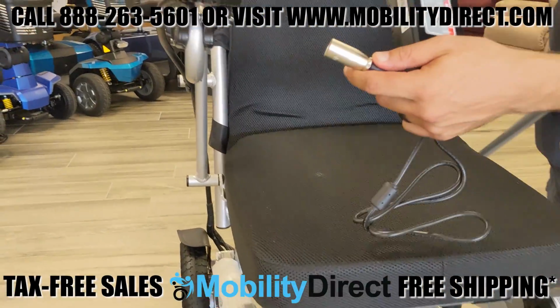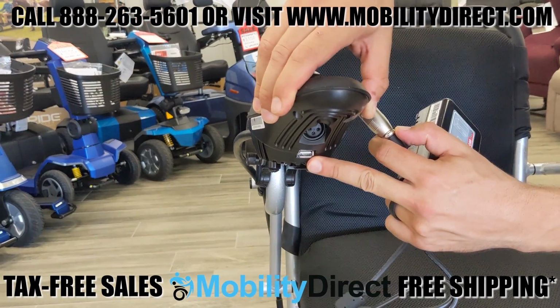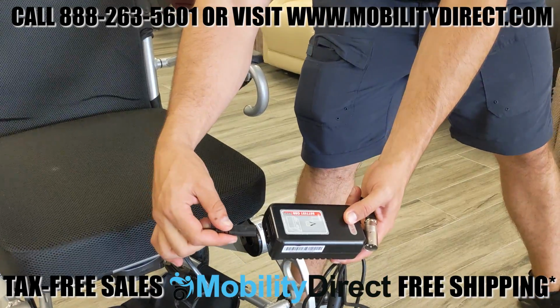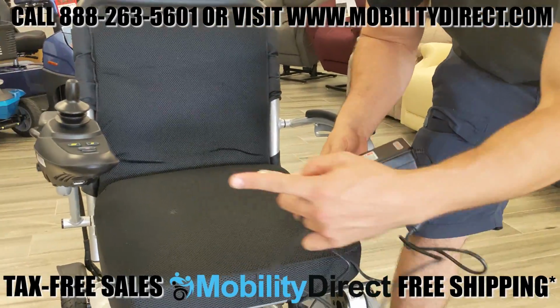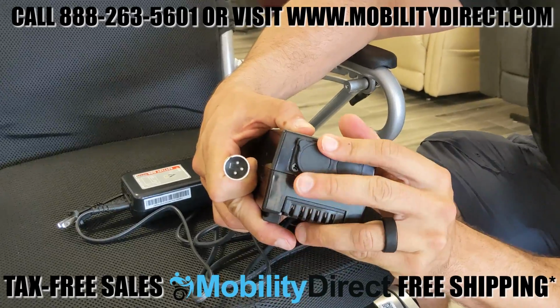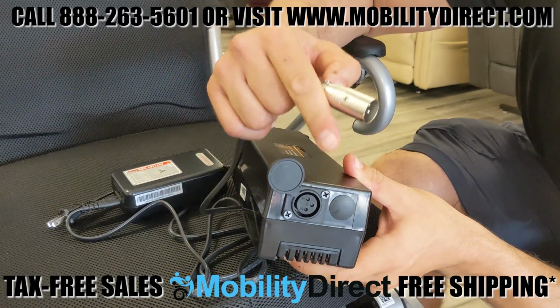You do have a battery meter on the joystick, as well as a USB charging port and the standard charging port. Again, you can charge this unit with the battery installed or removed. All you have to do is plug the wall outlet cable into the box, and then we're going to show you how that 3-pin barrel connector, known as an XLR barrel connector, gets plugged right into either the battery box or into the joystick charging port.